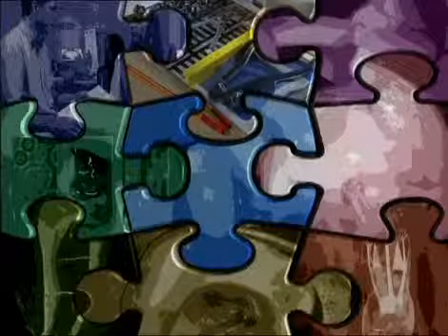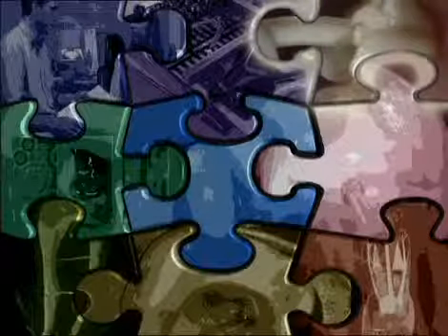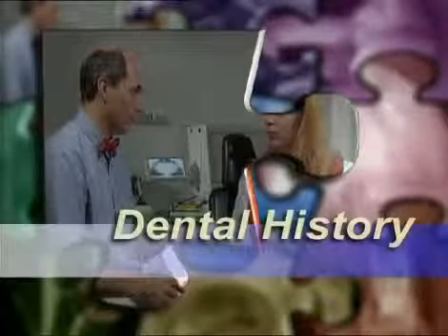After the application of rubber dam, the access cavity is prepared. Cleaning and shaping, mechanical sterilization, and 3-dimensional obturation are considered the most important steps during endodontic therapy. The endodontic therapy ends with the application of a well-fitting restoration in order to prevent coronal microleakage.